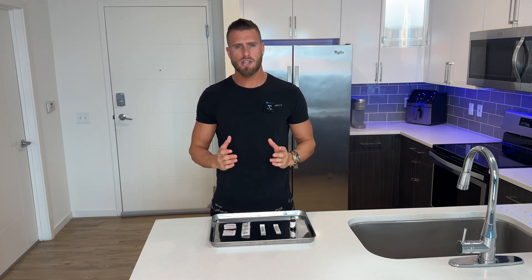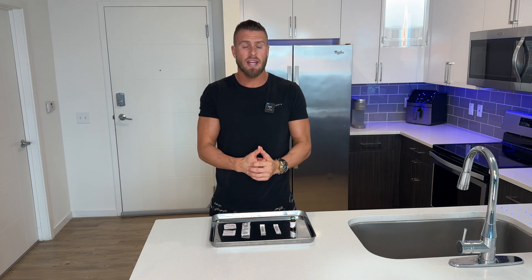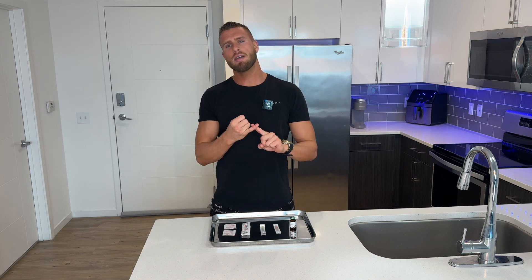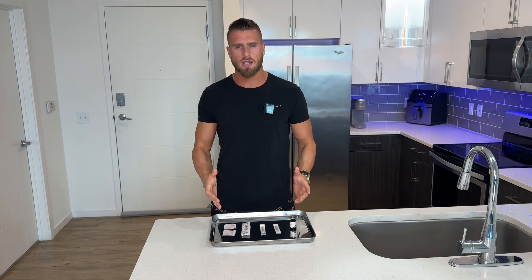How to set up your testosterone replacement therapy shot. I've been on TRT for over three years now, but I can remember back to my first injection and I was clueless of how to get this set up. Now that I've done over 300 of these injections myself, I'm gonna show you exactly how I find my dosage, how I prevent bubbles in my syringe, and also some tips and tricks I've picked up along the way to make this a pain-free experience.